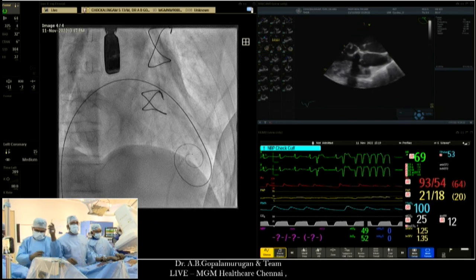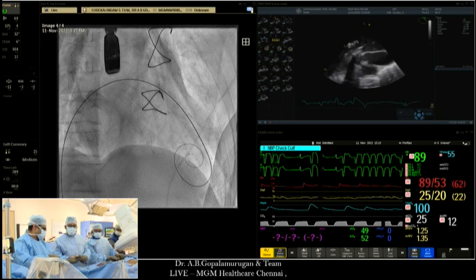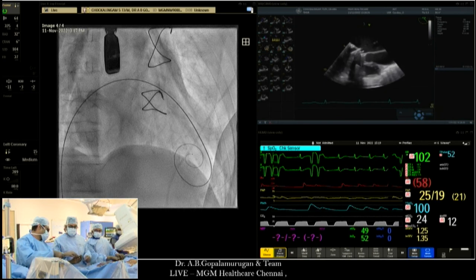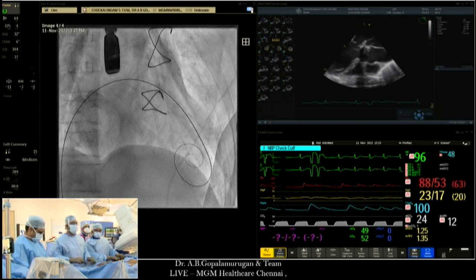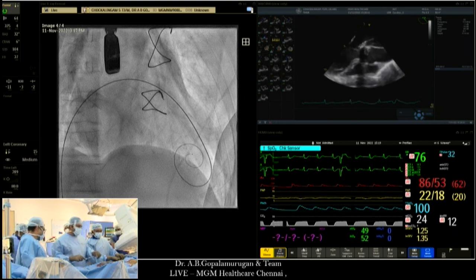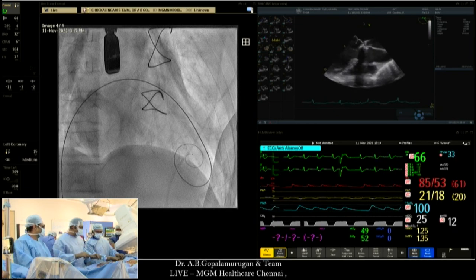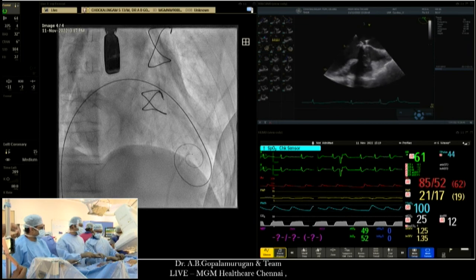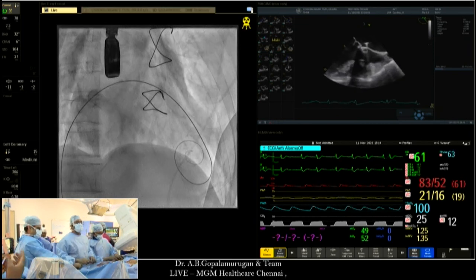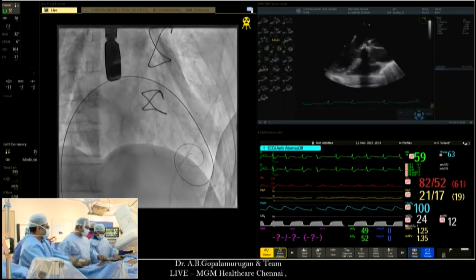I was unhappy, I took it out, and then it was the fourth time that you actually saw, because my plan was to get the transeptal so that you're all ready for the valve before, but it didn't work out as I planned. But it's crucial that we don't cut corners and take the quickest transeptal, because I have ended up in trouble in the past. And then you end up snaring the wire, then you'll have to take a VA loop. Sometimes there was once where the transeptal I thought was all good, but eventually it was horrible.